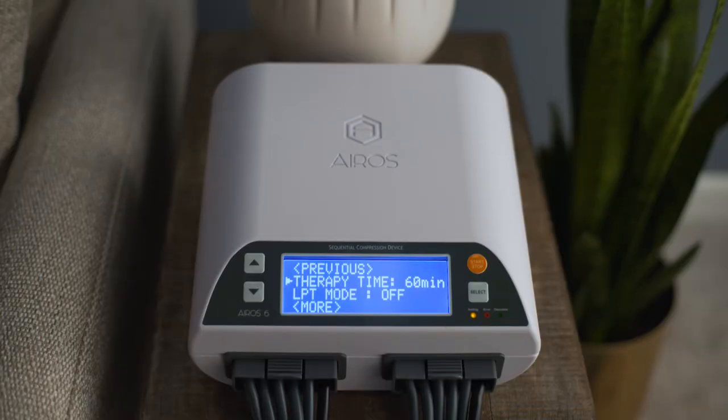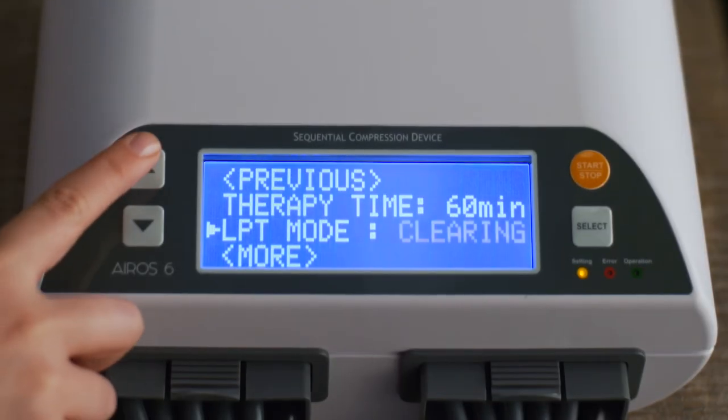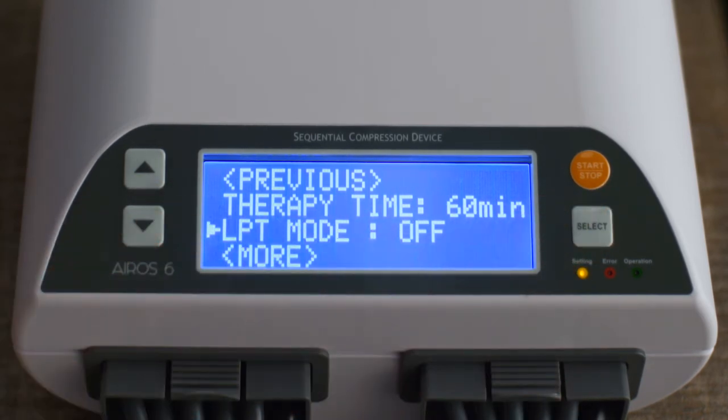To operate the device in a Lymphedema Preparation Treatment mode, which provides a secondary therapy before the main gradient mode therapy, scroll to LPT mode and press the Select button. LPT mode can be set to Clearing or Focal Modes. Press the Select button to confirm your selection.